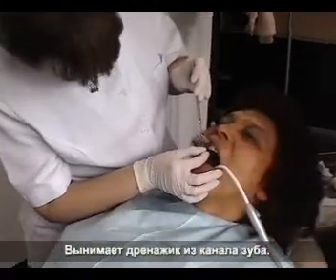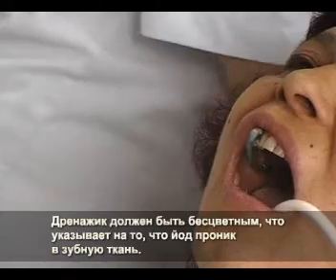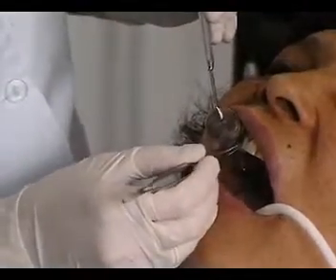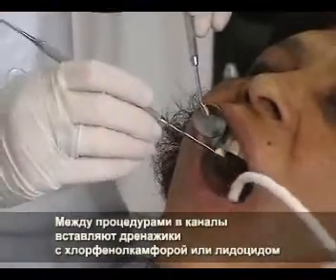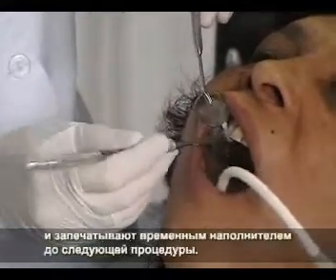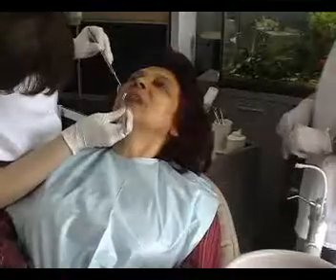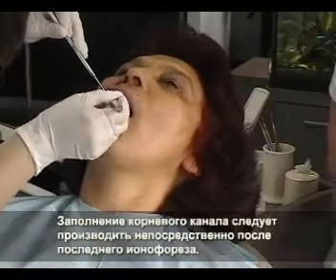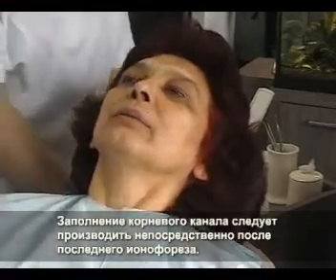The drain is taken out of the treated canal. The drain must be colorless, which indicates iodine penetration into the dental tissue. Drains with chlorophenol camphor or another disinfectant are placed in the canals between procedures, and the cavity is sealed by temporary filling until the next procedure. Usually three procedures are recommended, and root canal filling must be done immediately after the last ionophoresis.